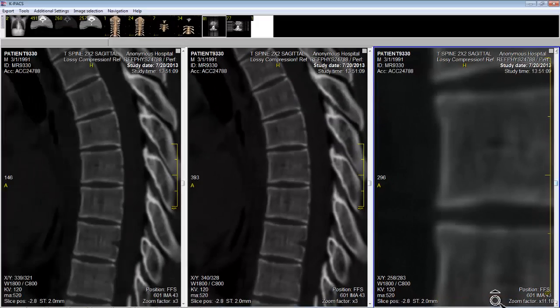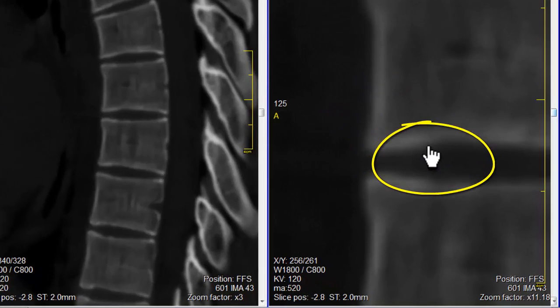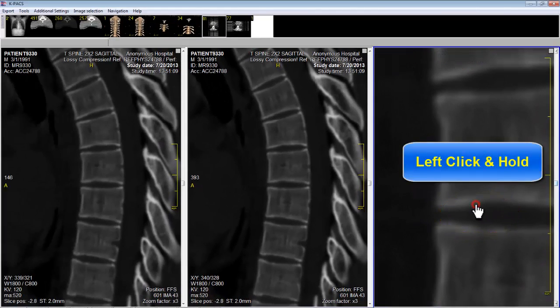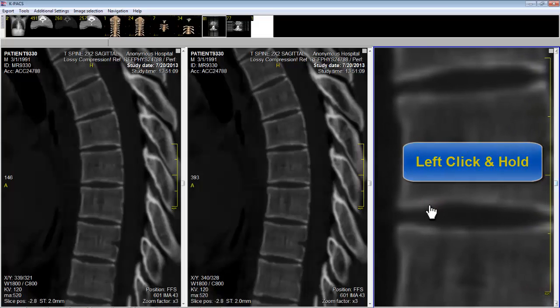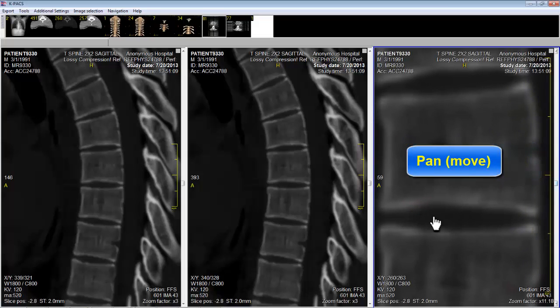Now you notice as I got this image very large, the vertebral column is no longer in the center of the screen. To center the vertebral column so I can study it, I move my cursor until it begins to look like a hand with a pointed finger. I left click and move the image, or pan the image, until it's centered in a location where I want to study it.